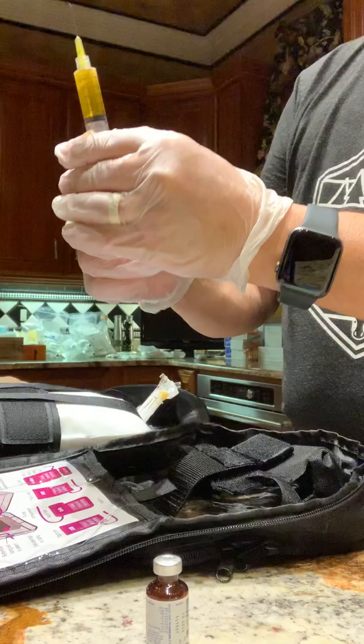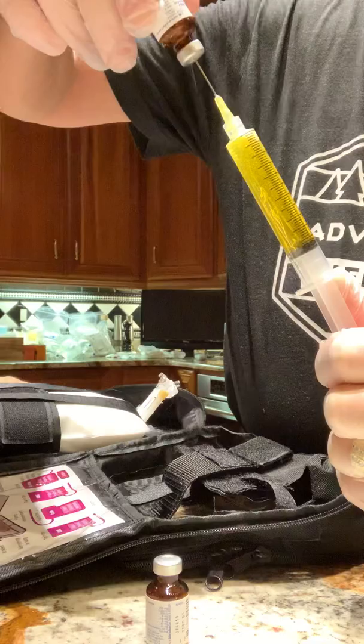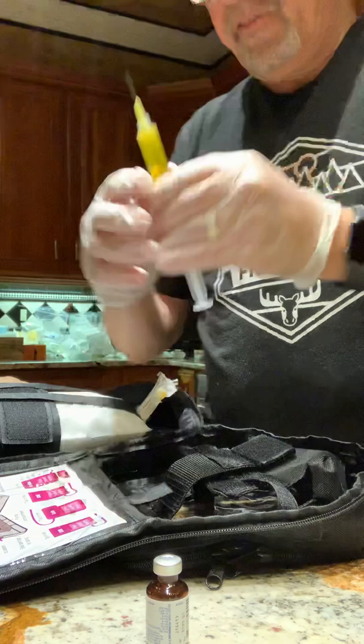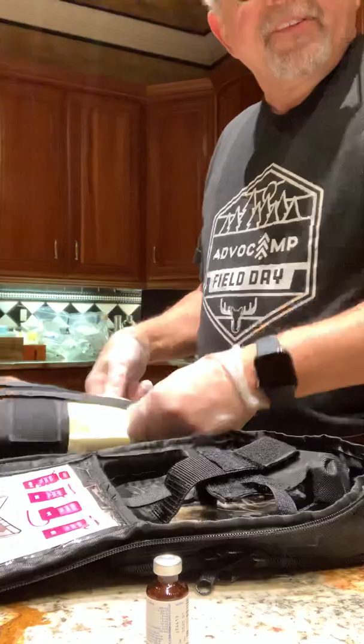Now we retrieve Part B of the multivitamin — it's a two-part solution. We draw it down to the 10-milliliter level, make sure we have all the contents out. Then we force any air out of the syringe and inject the multivitamin into the formula.